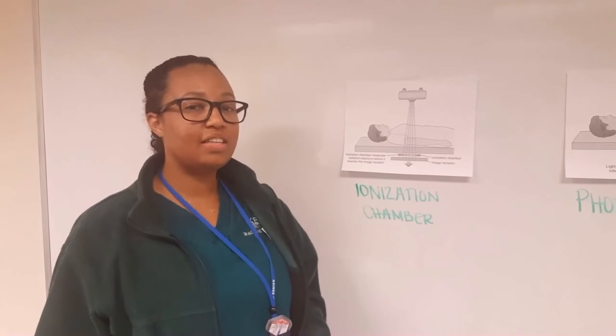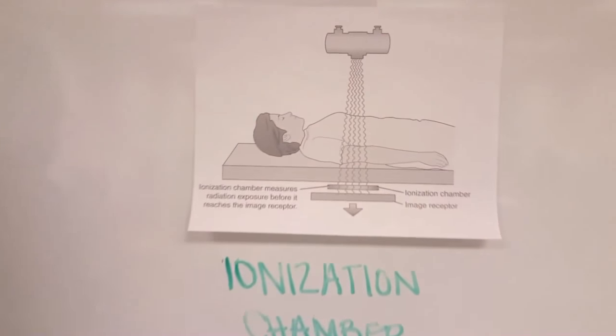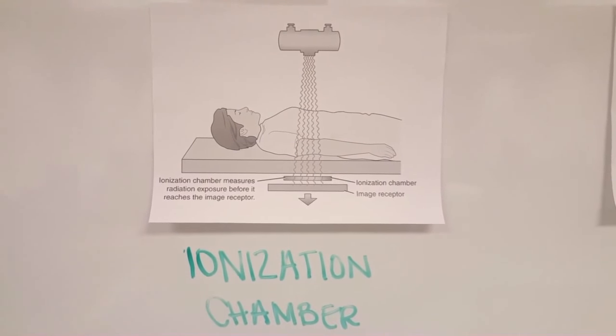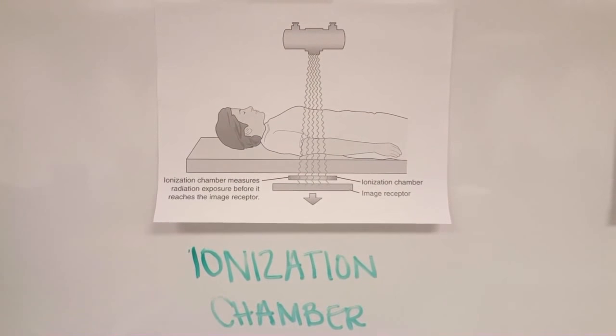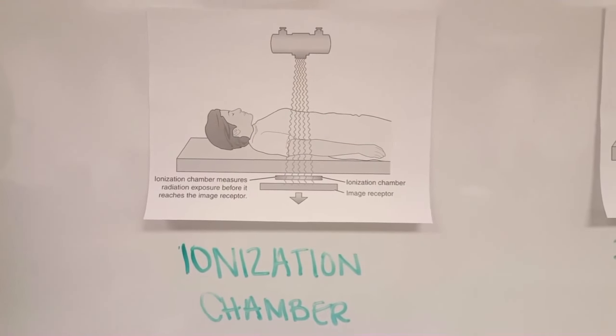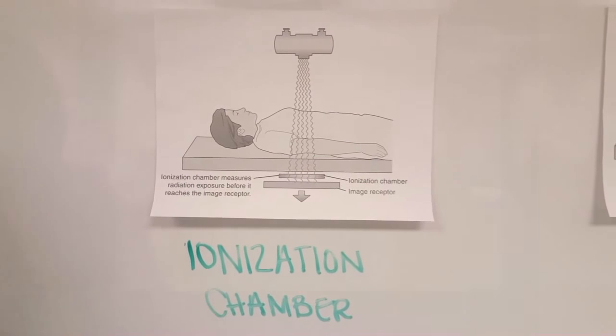The ionization chamber, on the other hand, makes use of a hollow cell filled with air, attached to a timer circuit by an electrical wire. When exposed to the X-ray photons, air in the cell becomes ionized. The electrical charge produced travels to the timer circuit via the electrical wire. When the predetermined amount is received, the timer is alarmed and radiation exposure is stopped.